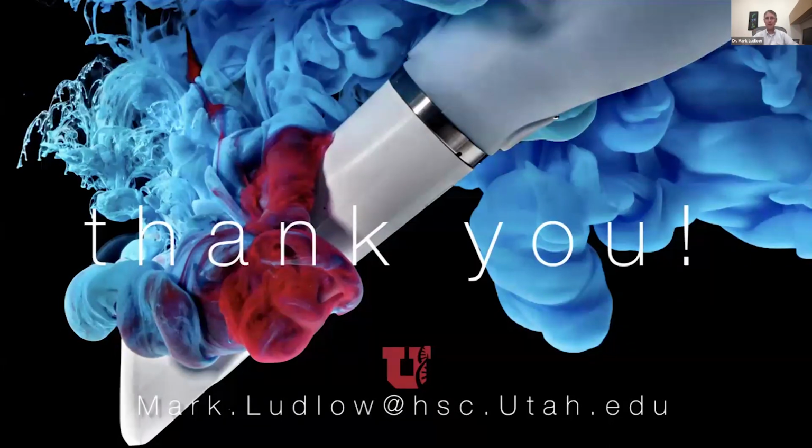So whatever scanner you have, just start using it, get used to using it, and just realize that every time it dings you and says update, you want to update that, because that's going to get your scanner better and better and better. So yeah, dust it off, squeegee it down, start scanning people, because you've got one and you may as well use it.